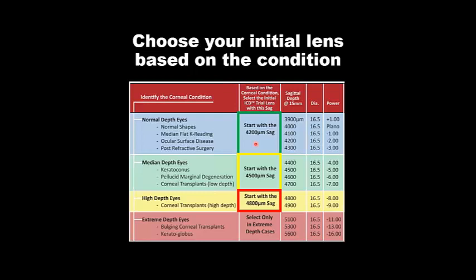Generally, it's better in trial lenses to start high. It's better to put on the lens with too much sagittal depth than call up the Cardinal consultant and say, I put on a lens that had 600 microns of apical clearance. Can you calculate the lens I need from that apical clearance? However, if you put on a lens that doesn't have enough depth and it hits the cornea, you have to put another trial lens on eye. So it's always better to err on the high side.